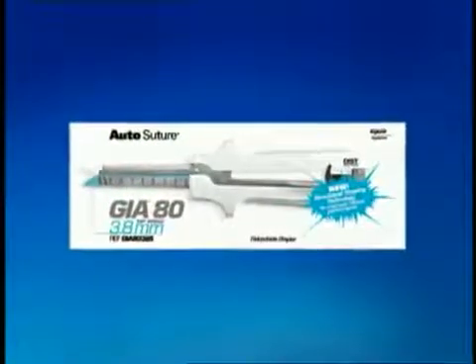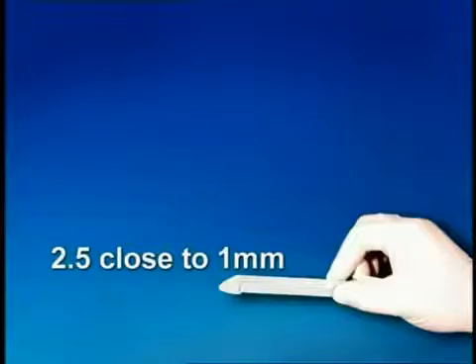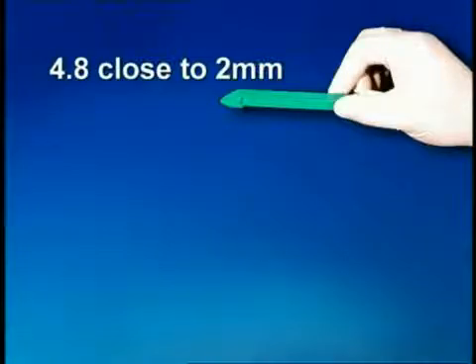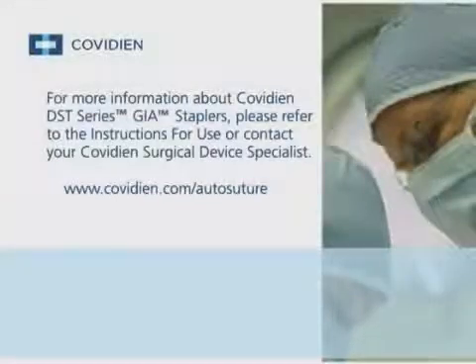The DST series GIA staplers come in a blister pack color-coded according to the size of the staple. The following staple closure sizes are estimates; actual closure sizes depend on tissue thickness. 2.5 staples close to 1 millimeter and the SULUs are white. 3.8 staples close to 1.5 millimeters and the SULUs are blue. 4.8 staples close to 2 millimeters and the SULUs are green. At Covidien, we never stop innovating and striving to exceed your expectations. For more information about Covidien DST series GIA staplers, please refer to the instructions for use or contact your Covidien surgical device specialist.